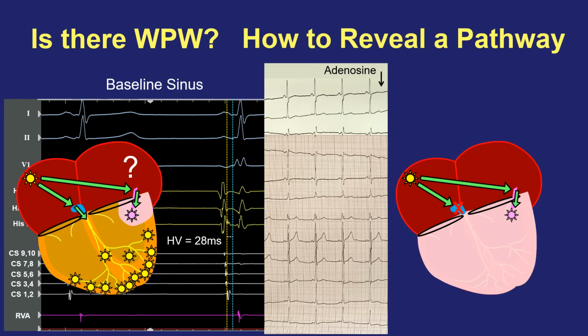And what will that look like? Well, you certainly will have a much wider QRS because you're no longer taking advantage of the rapid transit His-Purkinje tree, but instead you're conducting over the pathway and inserting directly into ventricular muscle. You'll still get to the entire ventricle, but in the same way that a PVC would if it were to come from this place of insertion of an accessory pathway. So you'll get a very wide, unusual looking QRS, even though it is conducted through an accessory pathway.